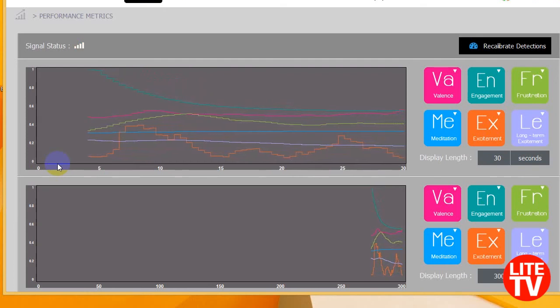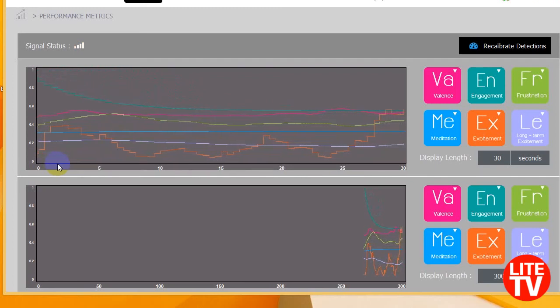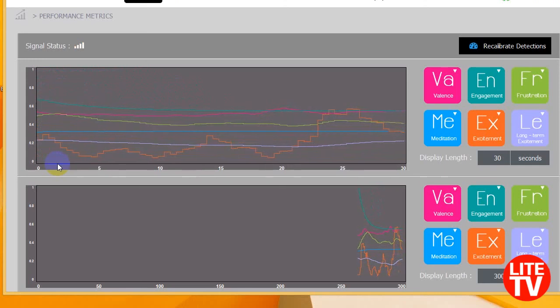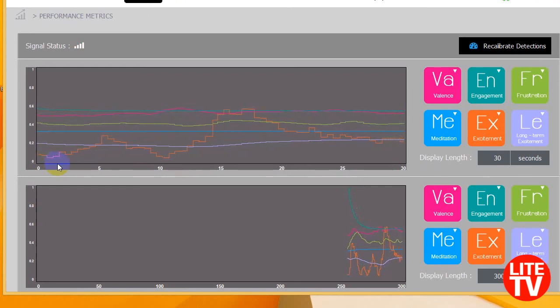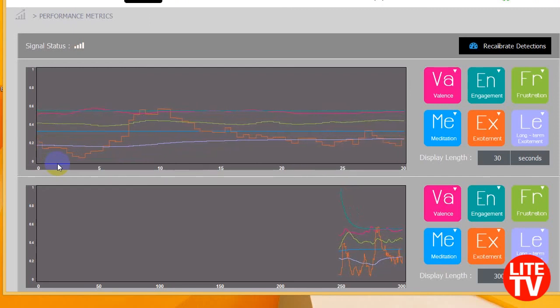And basically what this is showing you right here is that our participant, okay, now her excitement's going up quite a bit. It's that orange line right there. Her engagement is starting to slow down a little bit. Her frustration is somewhat neutral. But this is a pretty powerful tool to test your user's mood as he or she goes through the experiment.